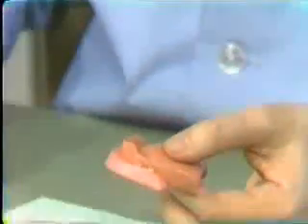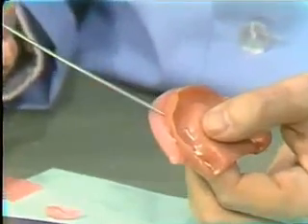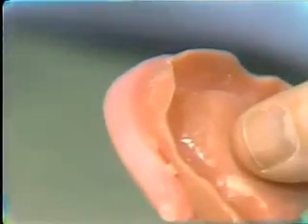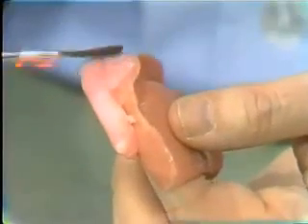Now, you'll notice that the first time you do this, you will probably not have enough wax in this area. Well, this can be added either by flowing it or by adding some small strips, because when you finish, this area should be smooth. We should not have a ledge in there. You can see that I just made an initial movement to fill that in, and then we can take a spatula and blend everything together.